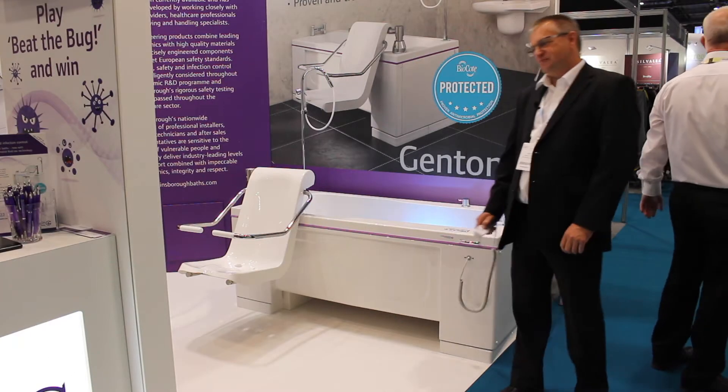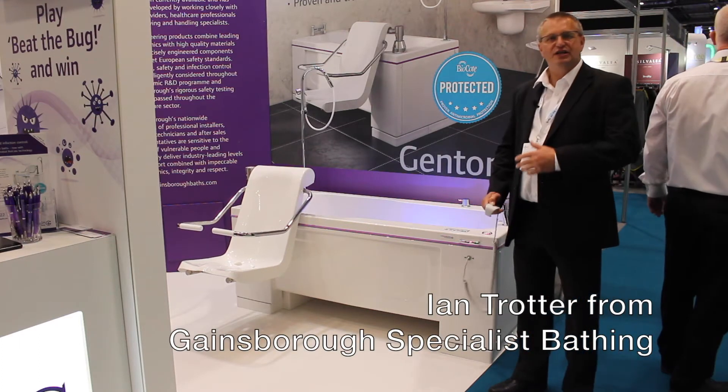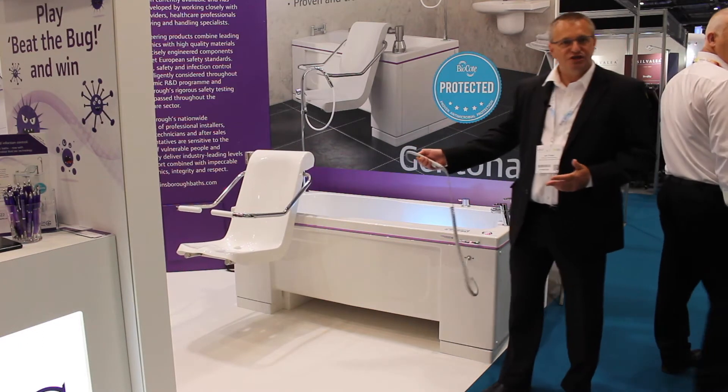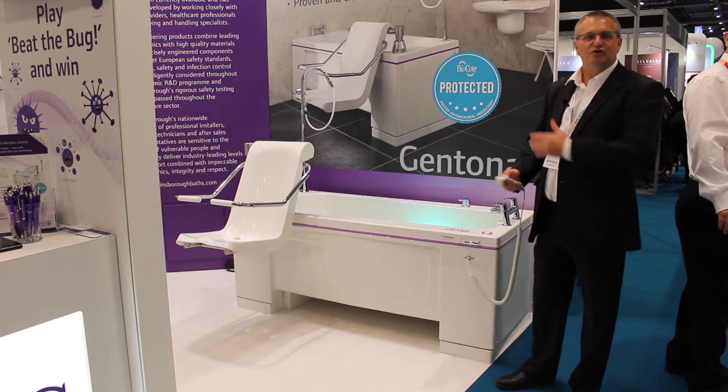Hi, I'm Ian from Gainsborough Specialist Bathing at HealthPlusCare. I'd like to go through the Gentona Hilo bath, if I may. It has a transfer chair. Quite simply, your client would sit on the transfer chair. It will raise you up and bring you across into the bath.